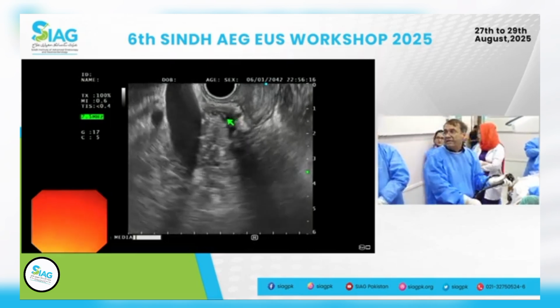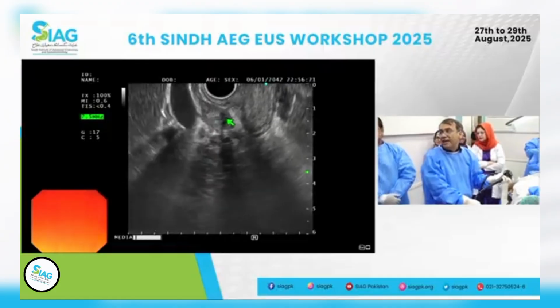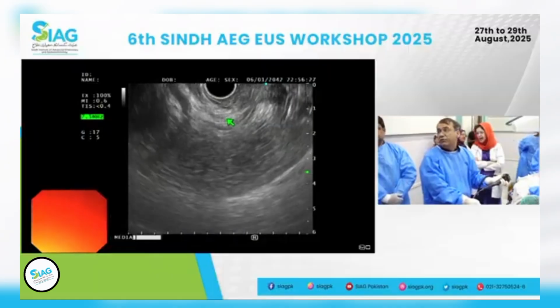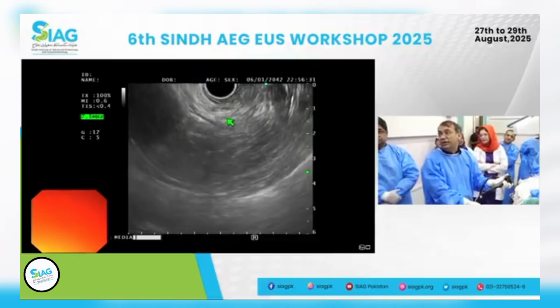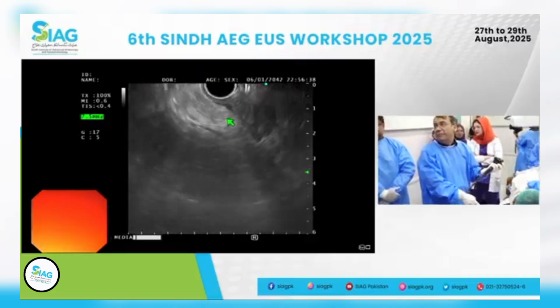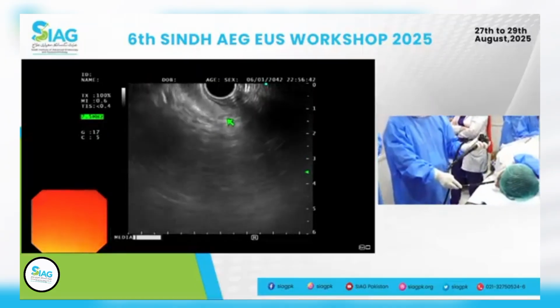Bile duct, I will keep that at 6 o'clock position. And you see how it moved away? I gently adjusted my scope and came back using suction. It moved away towards the op. So if it's going to keep doing that to me, I need to do something different than what I did earlier. So what I'll do is right now, I will move the big wheel away from me and see if that helps. It did help a little bit.